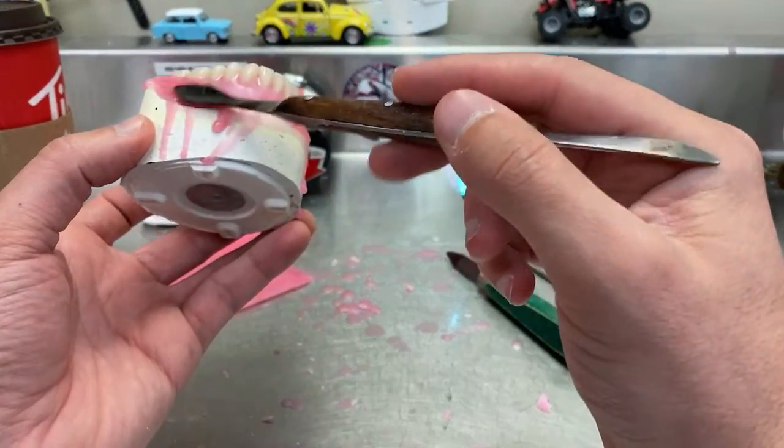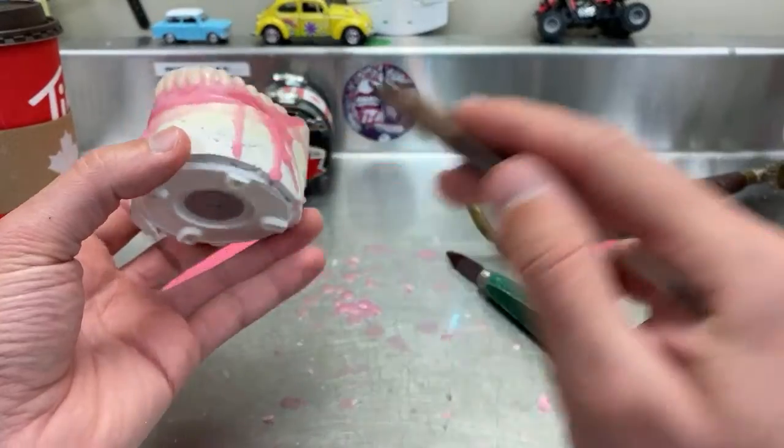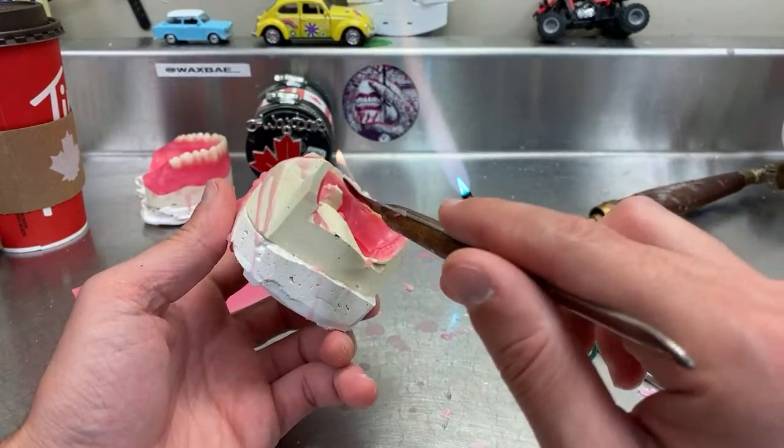If you just joined us, I'm doing some wax up here. This is the same thing that I did to the upper, but this is faster because there's no festooning or anything. It's just gonna do it quickly.